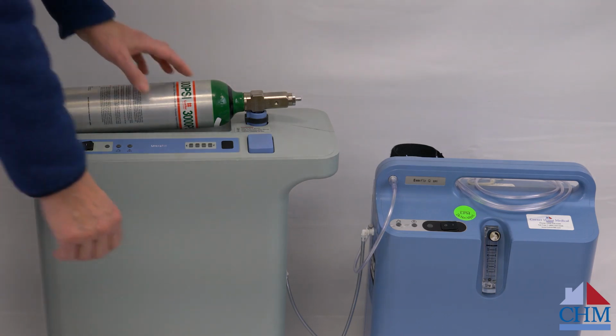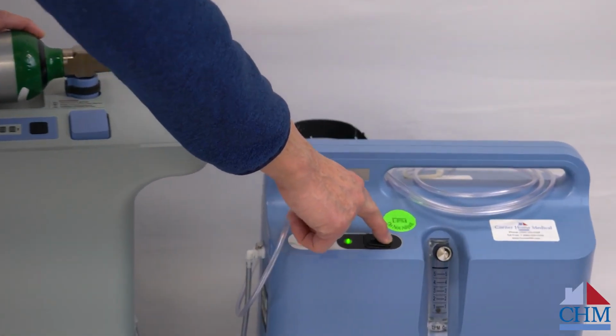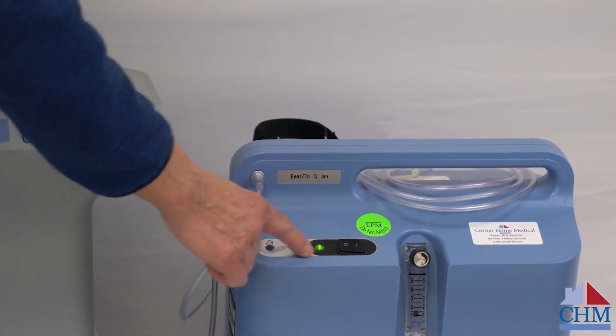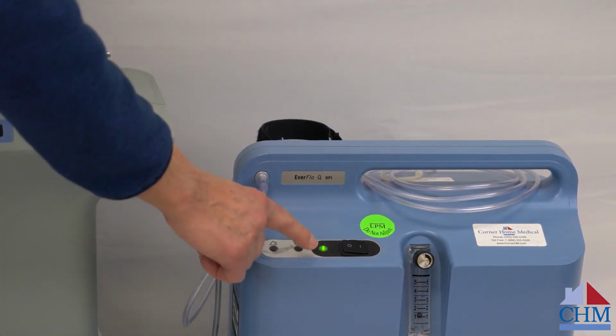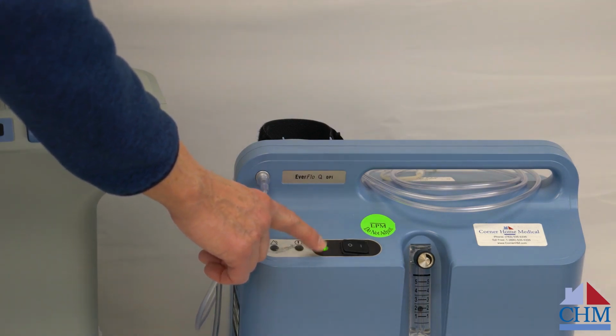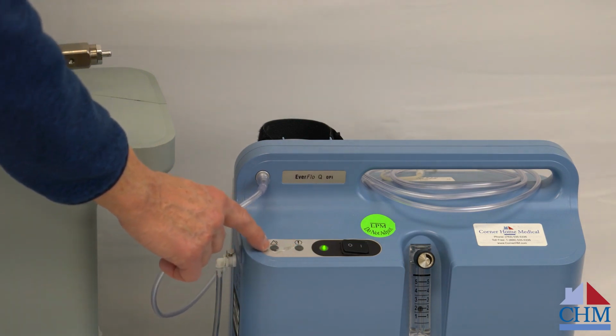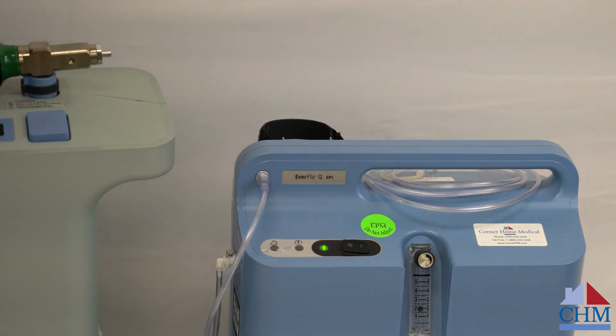So when I start this machine, I'm going to go ahead and hit the power switch here. And you'll notice at first I get all the lights on, then just the power light. Now, unless there's a problem, just that power light will come on. Otherwise, either of these other indicators, yellow or red lights, will come on to indicate that there's a problem with the machine, which of course you would need to call Corner Home Medical in order to take care of that.